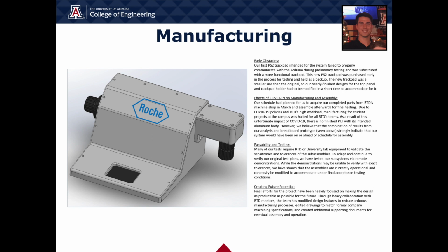As a part of our risk mitigation plan, the trackpad was the first subassembly to be prototyped since it had the highest risk. Unfortunately, our ideal trackpad had faulty connections and could not operate at an effective rate, but we were prepared with a second trackpad from a different manufacturer.